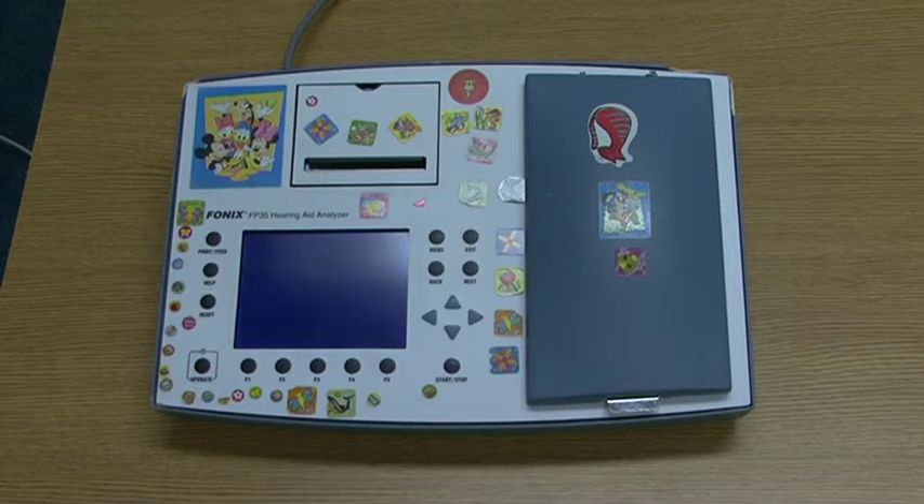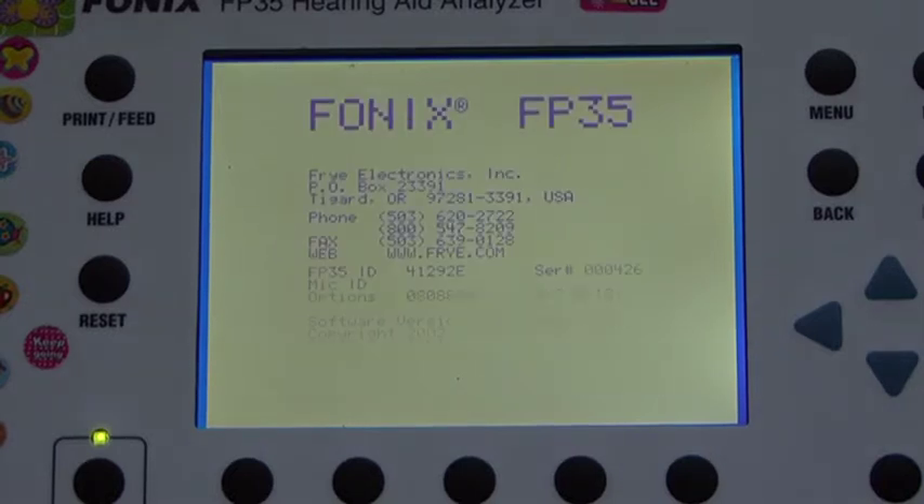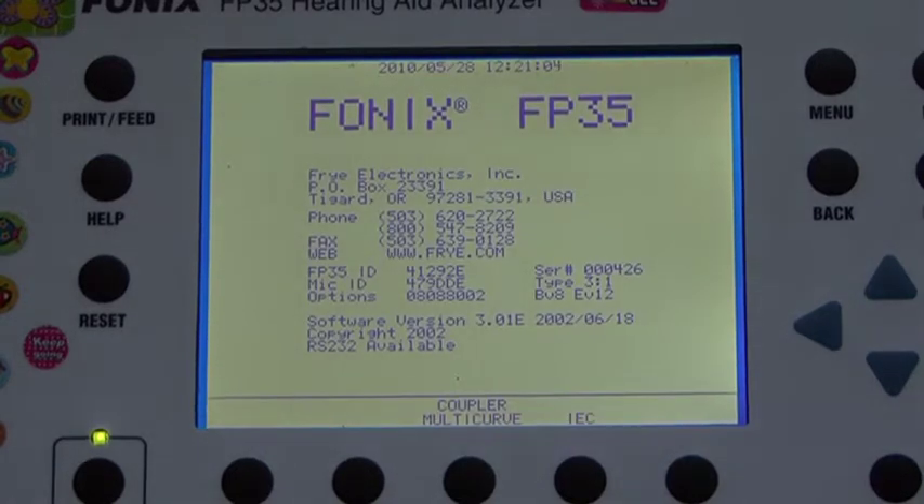The mains power LED above the operate button will light and the screen will display its initializing screen. After a few seconds, the main start-up screen should be displayed. If the screen is not displayed or unclear, please try adjusting the contrast control knob located at the rear of the test box.